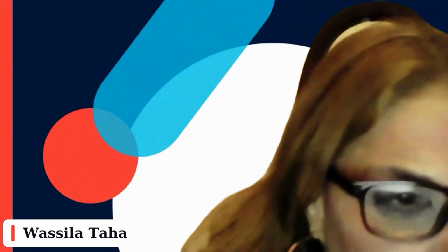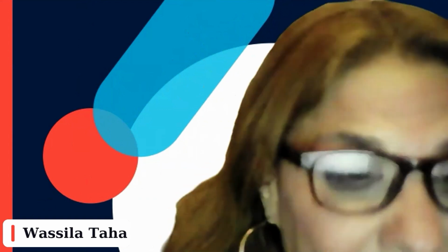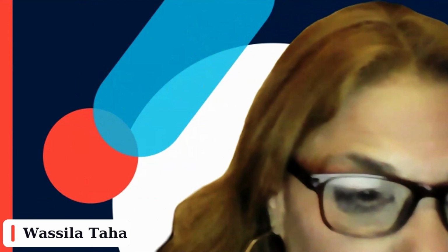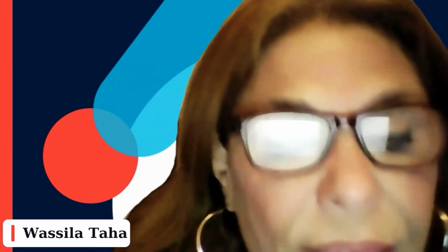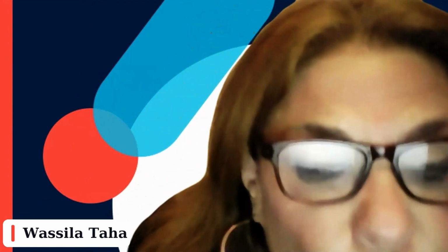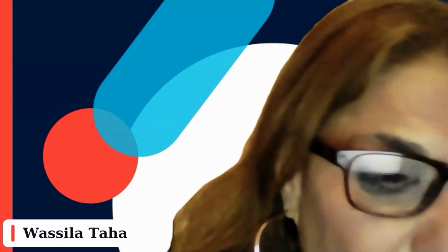As mentioned, we close the perforator, but we also have the varicose vein here. For sure, it is a good indication for foam sclerotherapy. I would inject 1% polidocanol foam in the varicose vein at the thigh level. Thank you, Claudine, for your valuable contribution. It's a true honor having you with us.